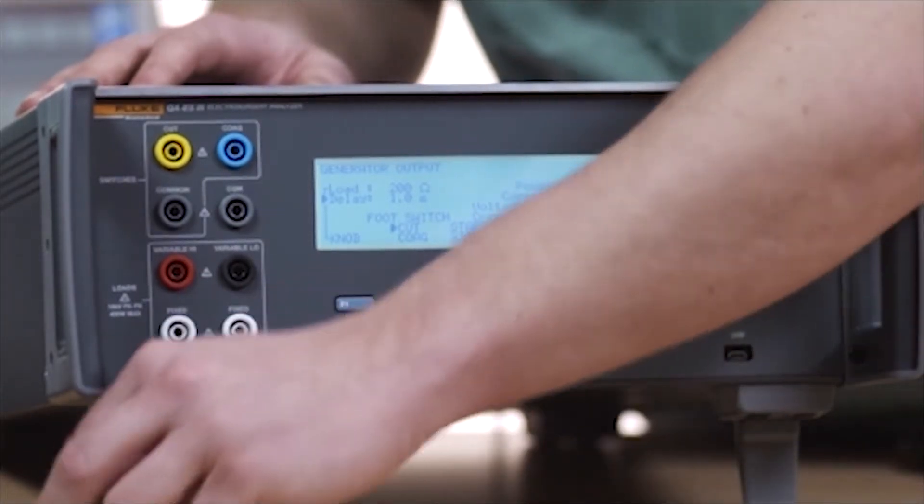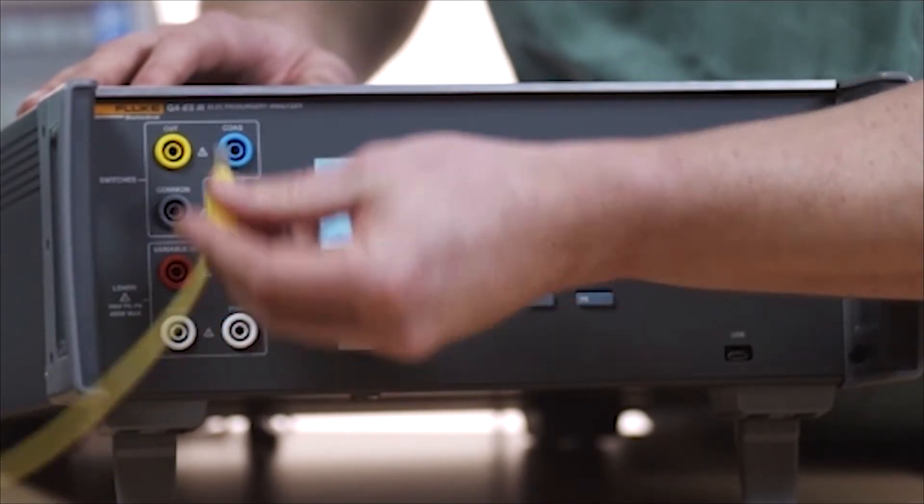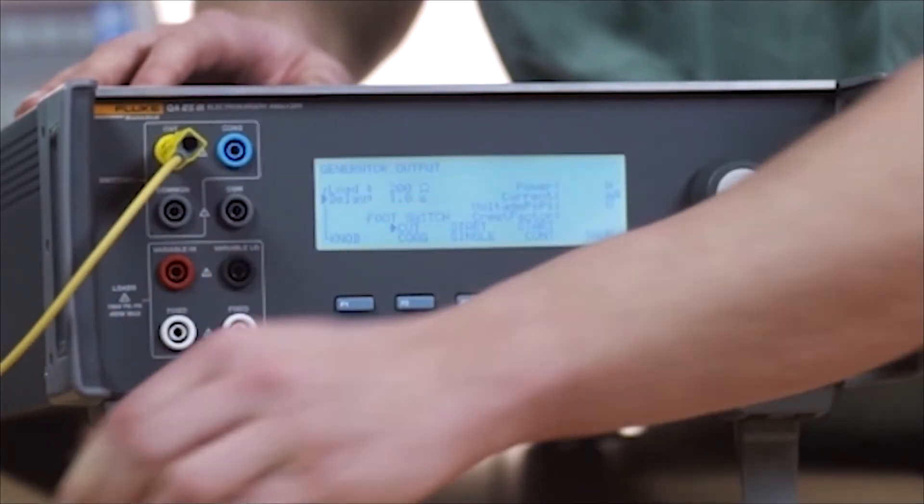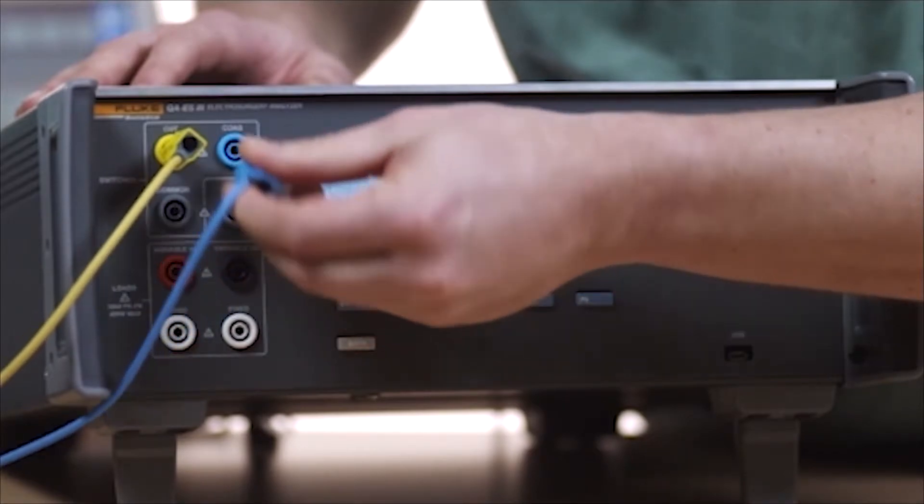Connect the footswitch. Plug the ESU cut switch into the cut jack and the ESU coag switch into the coag jack.